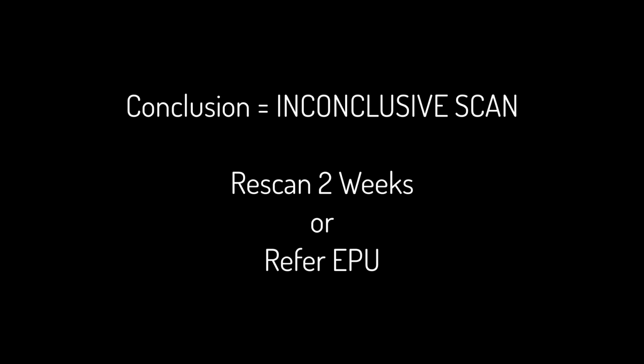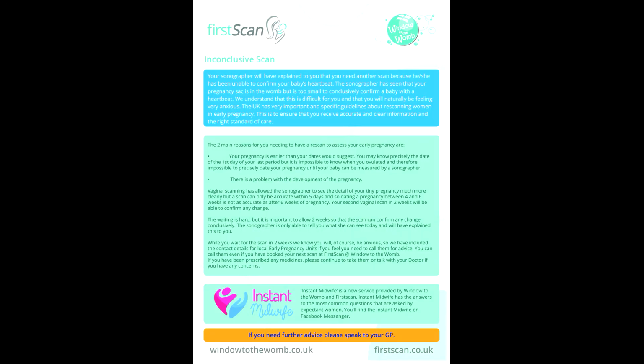The conclusion must be inconclusive scan, rescan 2 weeks, or refer early pregnancy unit. The woman must be given the information leaflet for inconclusive scan so that she has something to read when she gets home.